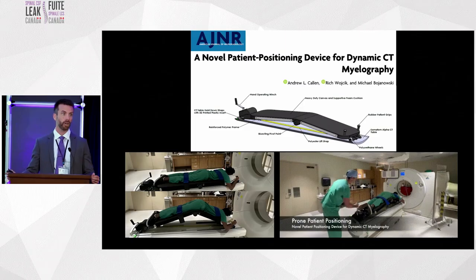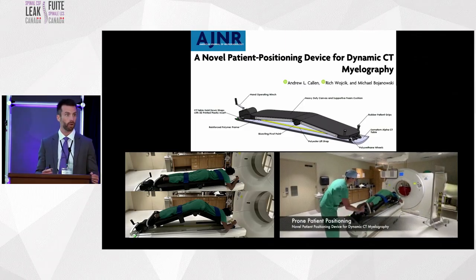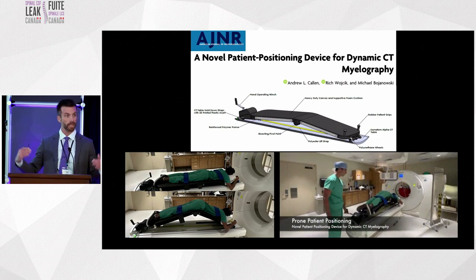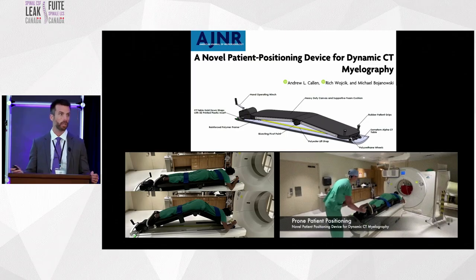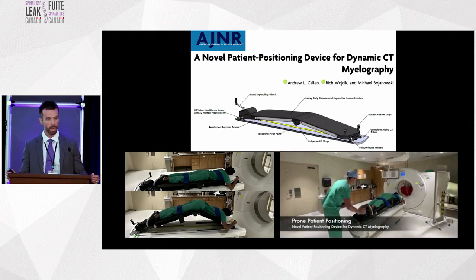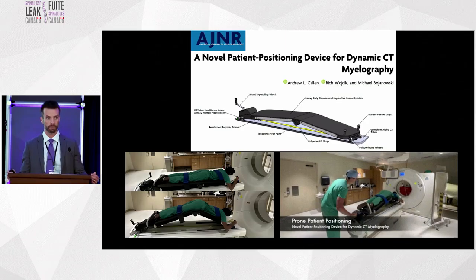This is not a very complex device. It's just a very strong plastic frame with a hand-operated winch that can basically pull these two sides together and give you the ability to tilt the patient. This hooks directly onto the table, and we found this to be very useful for myelography and allowing us to have that control of our contrast bolus in that way.